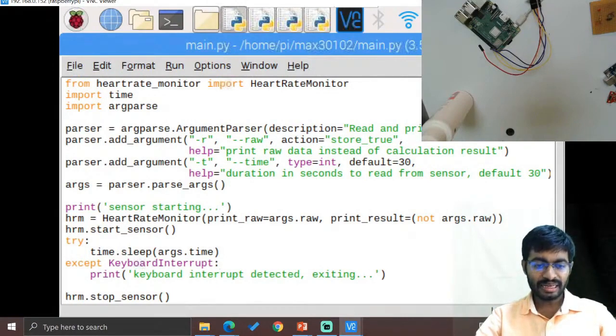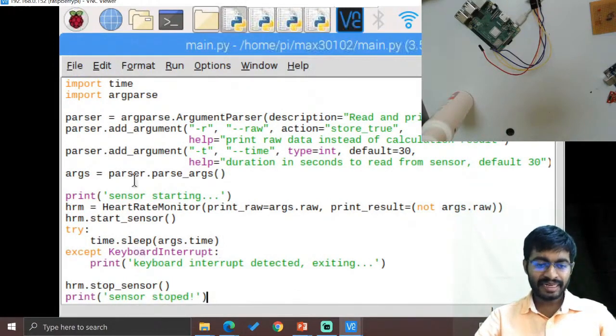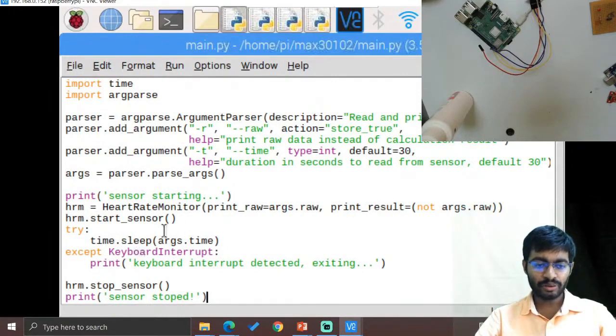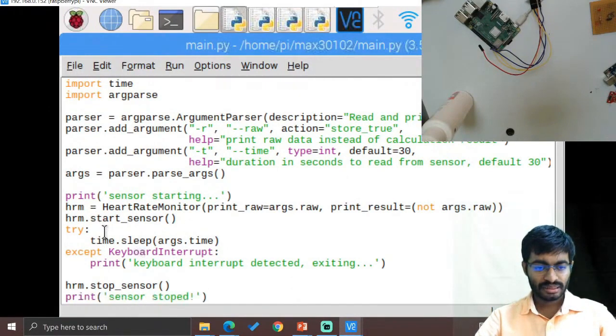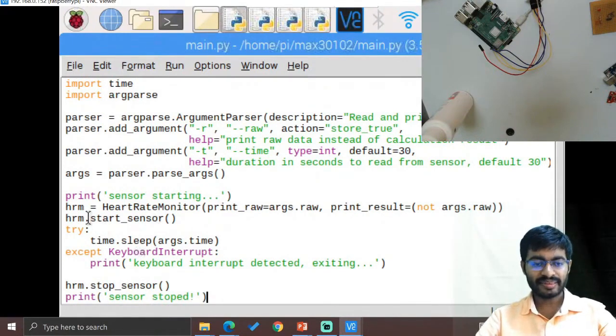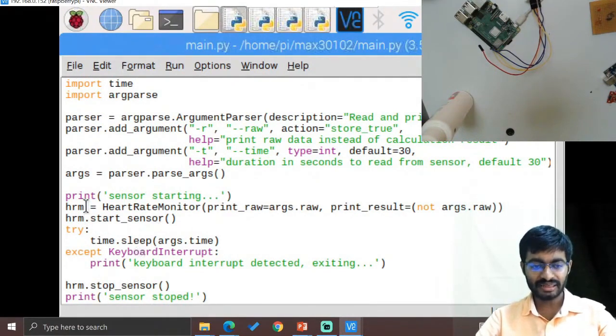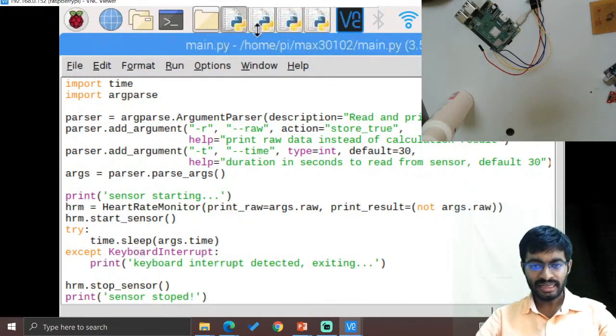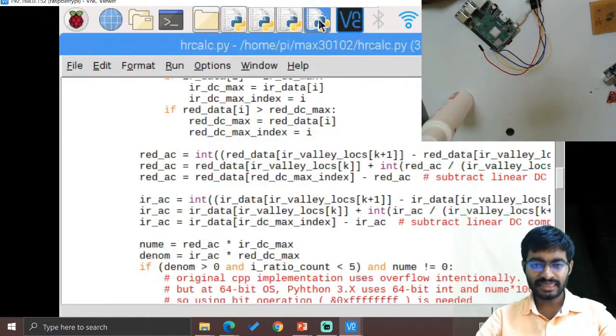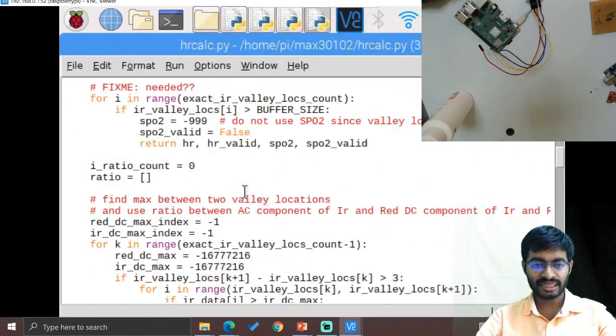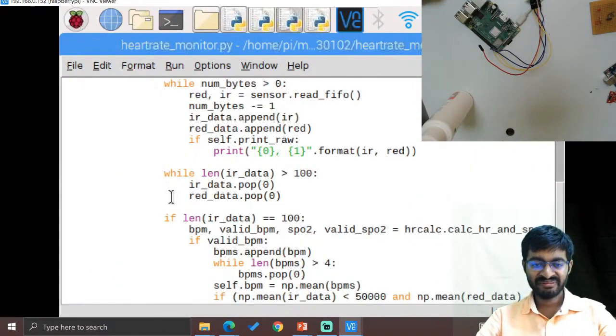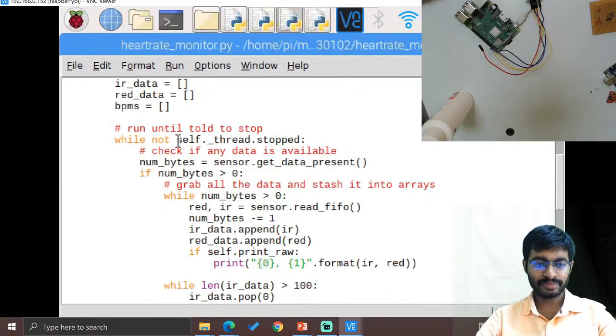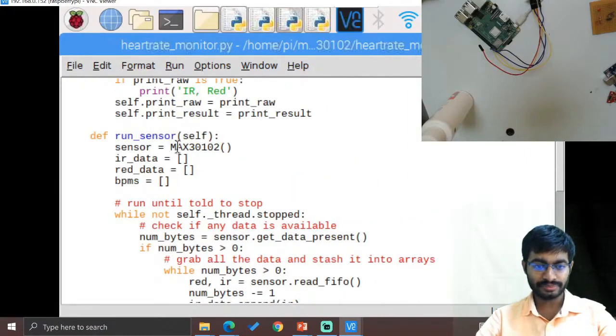So until the keyboard interrupt is directed, the complete section will be applied over here continuously. So here you will be thinking how it will be working continuously because here we have not provided any of the while loops, but that also will be working because inside this we have initiated with while loop inside heart rate monitoring. So this completely comes under the while loop data.